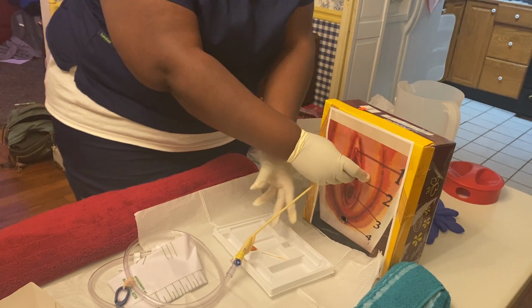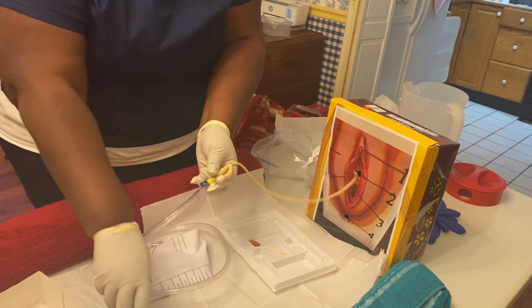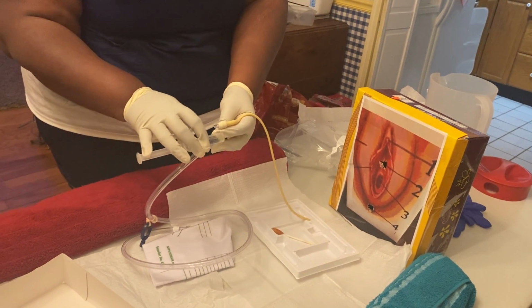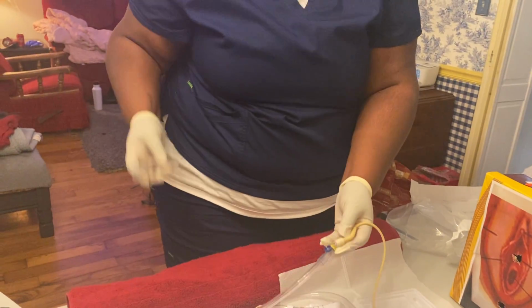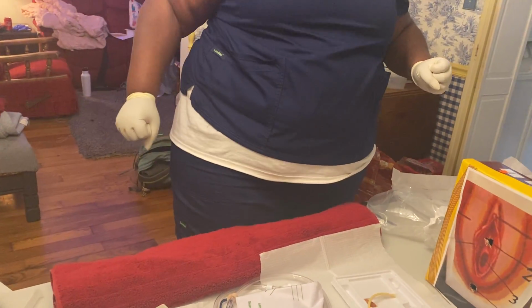And then, with my syringe that was already attached, I would do this, but I'm not going to put my syringe in today because I don't want the water to get out.